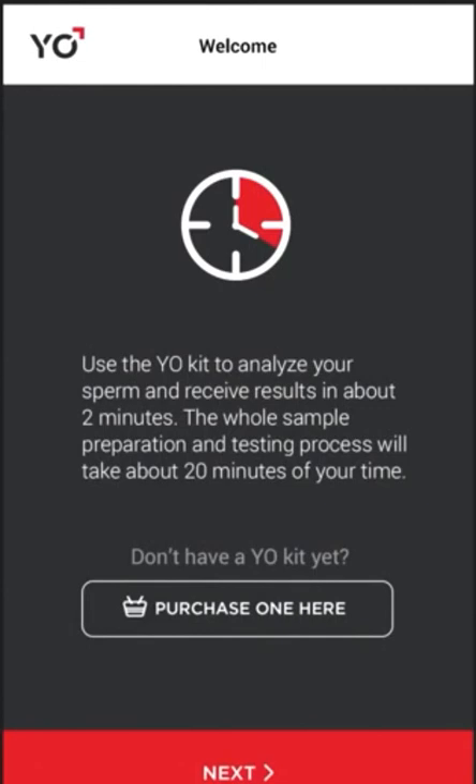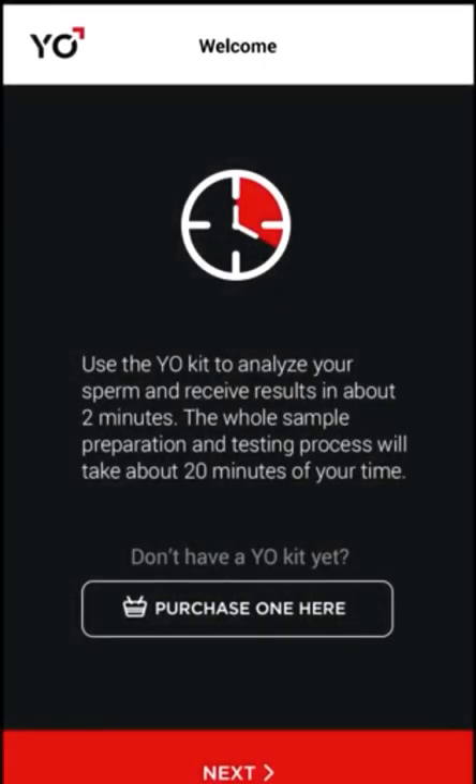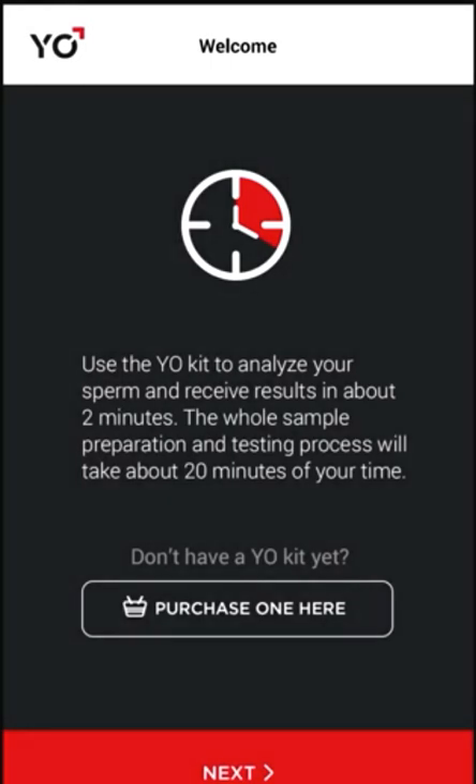Prepare your phone before starting. Charge it to 50%, place it on airplane mode, and password protect your phone to ensure medical confidentiality.